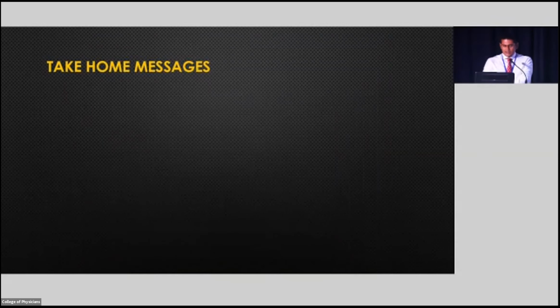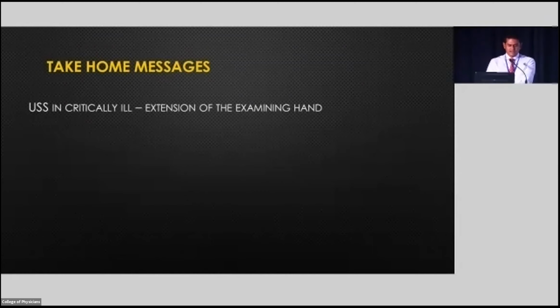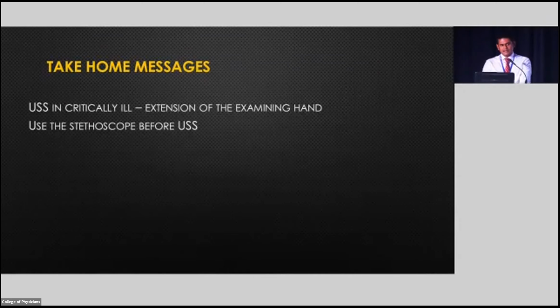So, take home messages from my lecture. Ultrasonography in the critically ill is basically an extension of your examining hand. It's a valuable tool. But always use the clinical setting and always use the stethoscope before you use the ultrasound, because then the diagnostic accuracy will be very high.